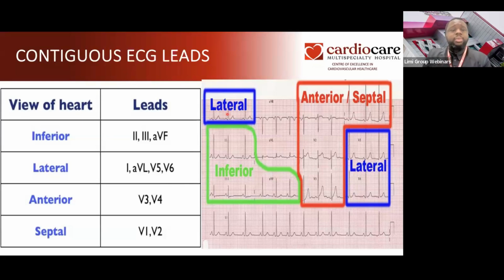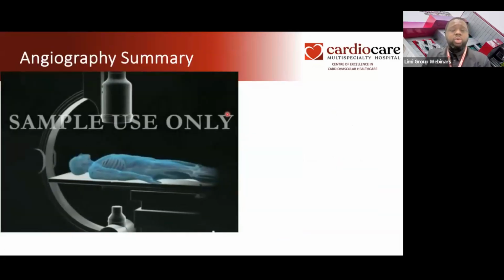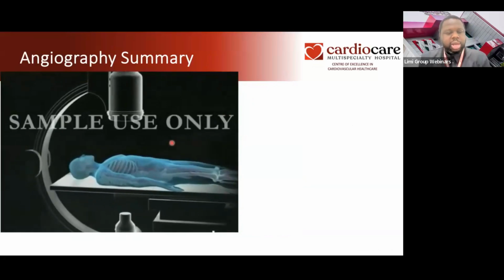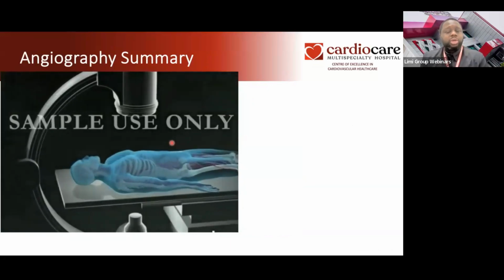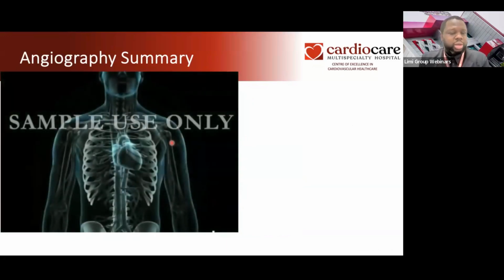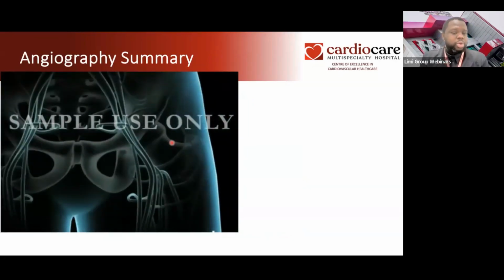All right. So again, for those that are just joining us, we talked about the coronary angio. Patients should ideally do it in a cath lab. Now we know of patients... So Ogumodere was asking about patients dying on the table during coronary angio. I know of people that sometimes use C-arms or other things to do a coronary angio. Sometimes that can work, but if you run into trouble, you're probably on your own.